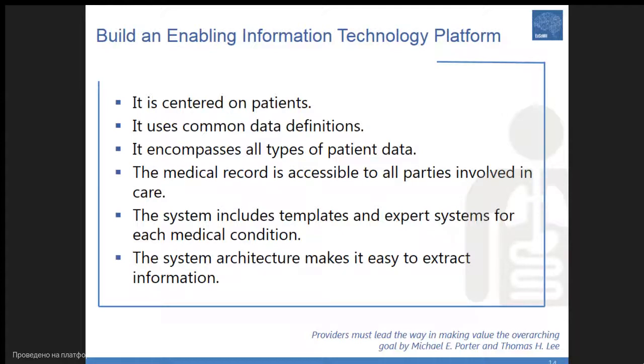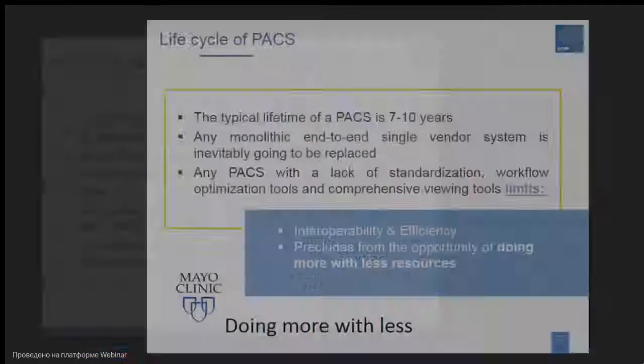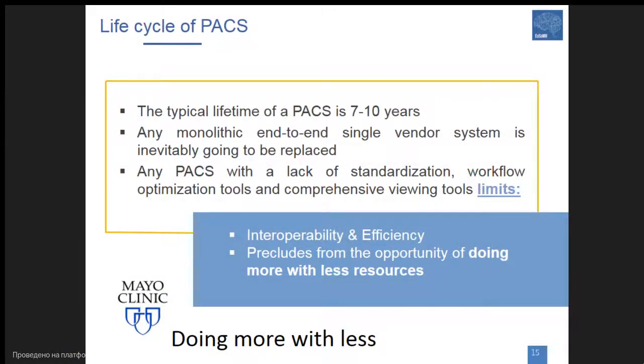Especially this is important when we use radiology for screening, for population-based studies in order to analyze the effects of screening on the population. So the typical lifetime of PACS is 7-10 years, and any old single vendor system will inevitably be replaced.